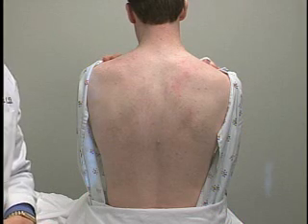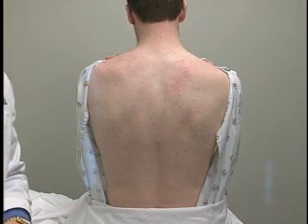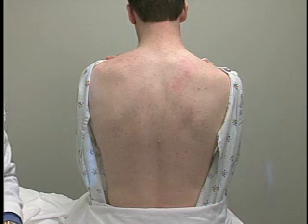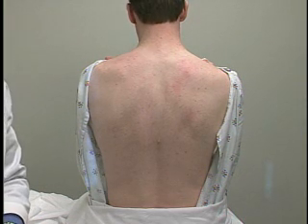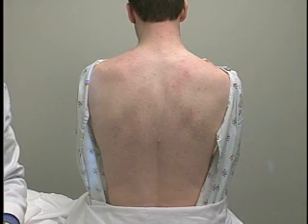If you are not able to hear breath sounds adequately when you begin, ask the patient to take somewhat deeper breaths. I can also refer you to Dr. Chandrasekhar's physical exam on the lumen to hear examples of bronchial, bronchovesicular, and other breath sounds.